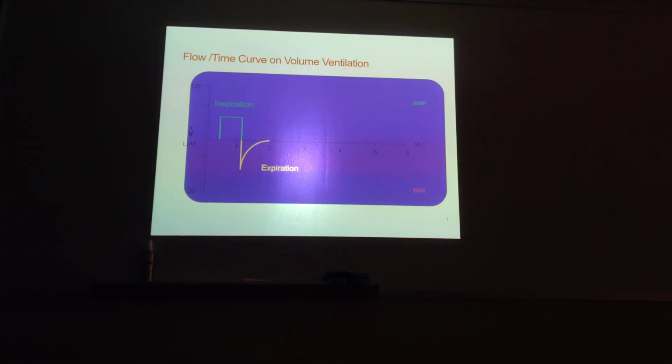But the disadvantage is that there is likelihood of barotrauma because the PIP tends to be higher from beginning to end. So at the hospitals, they don't like to use the square flow pattern, because it creates a higher PIP and can predispose the patient to developing barotrauma.